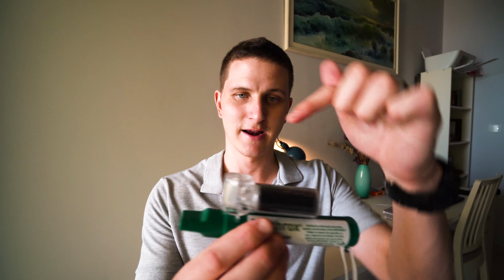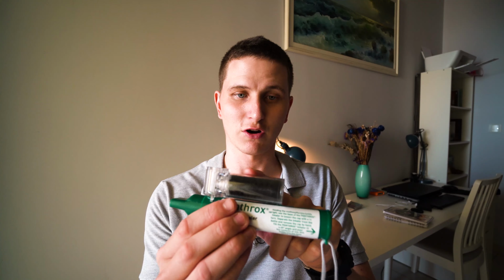This little thing at the top here is actually just activated charcoal. What that does is that it absorbs all the drug that's being breathed out of the patient. So they mustn't breathe in and then breathe out into the air. You must breathe in and out through the pen so that all of the drug that they exhale gets absorbed by the charcoal. In ambulances, or in hospitals, depending on how big the room is, sometimes they're breathing out into the air, and so the practitioners who are close to them are breathing this in all day, and it actually gives you quite a headache. And I'm sure it can't be good for your kidneys either. So they breathe in through there, air goes in there, and when they breathe out, it comes through the charcoal, and that deactivates the drug that comes out the top.